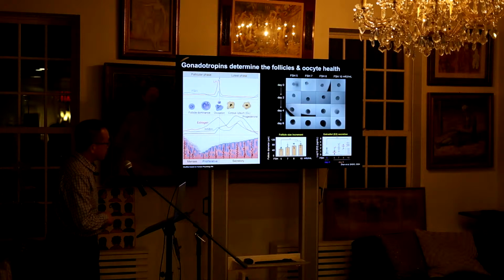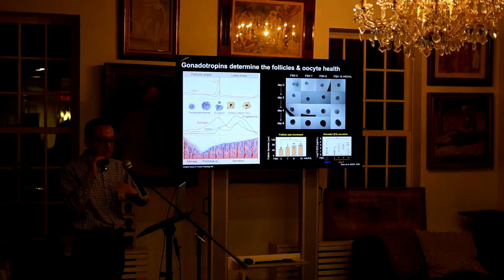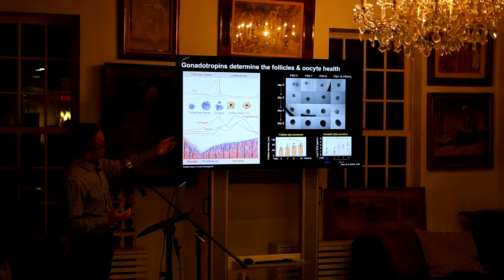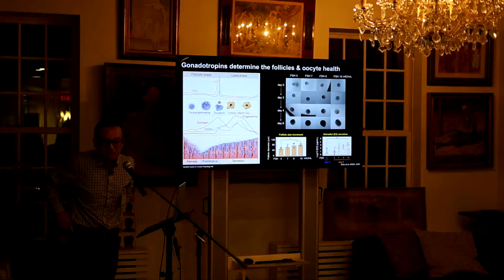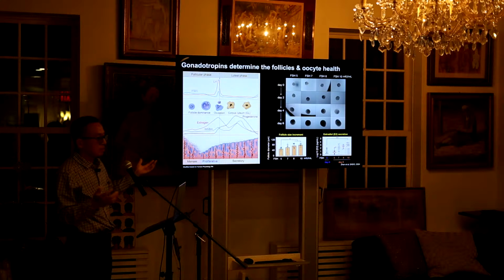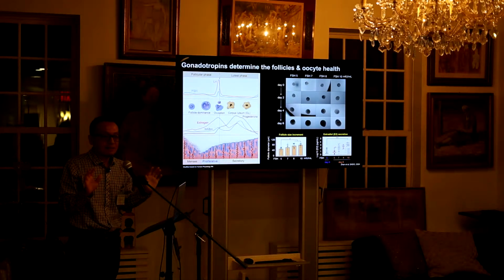So what we did is use our follicle culture model and give them different FSH to see whether there's a threshold required for the follicle to acquire dominancy or maturation, so they can go through the whole process and become ready for ovulation. Overall, the answer is yes. In our follicle culture system, we give them different concentrations of FSH: 5, 7, 8, and 10 milli-IU per ml. And from the figure, you can see that 5 didn't do anything.